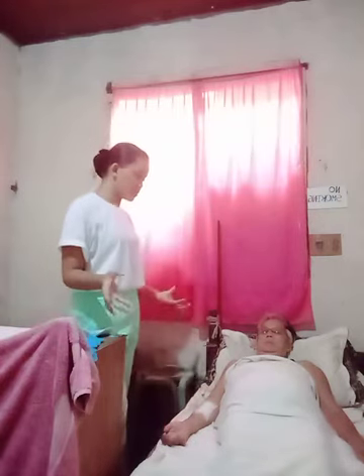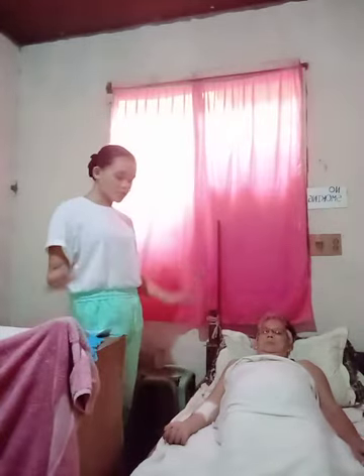For the first procedure, review the medical forms for the dressing change procedure, explain the procedure to the client, and instruct the client not to touch the wound area or sterile supplies. Introduce yourself and ask the name of the patient.